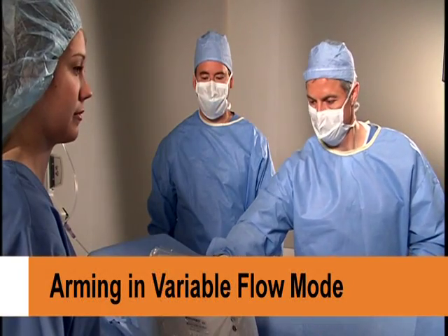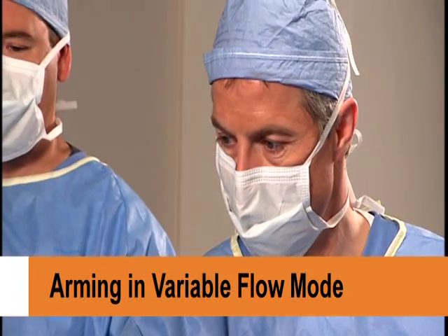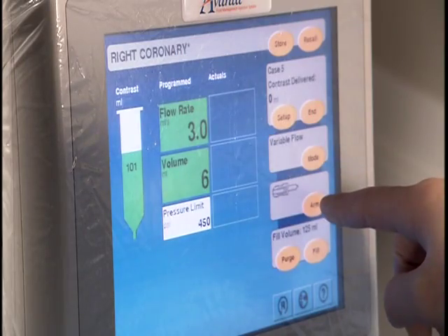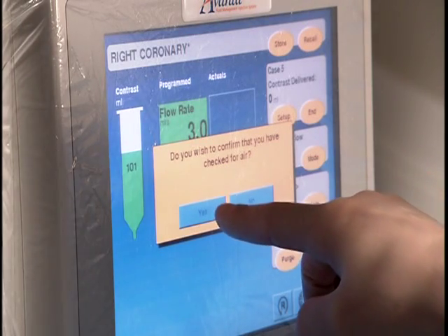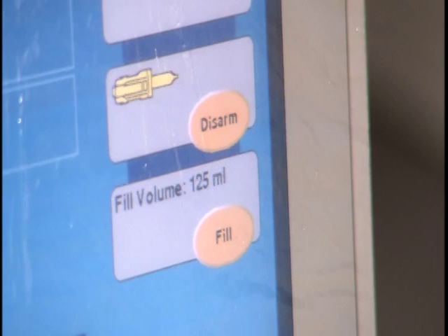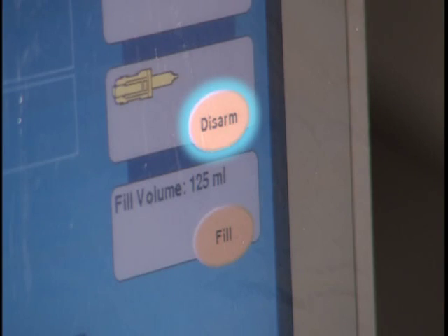When arming in the variable flow mode, begin by verifying that air is purged from the disposables. Touch Arm in preparation for the injection. The injector will remain armed and ready for fluid delivery until you select Disarm.